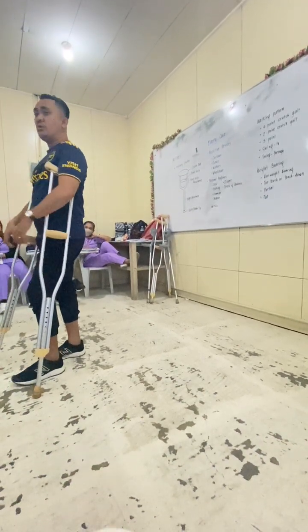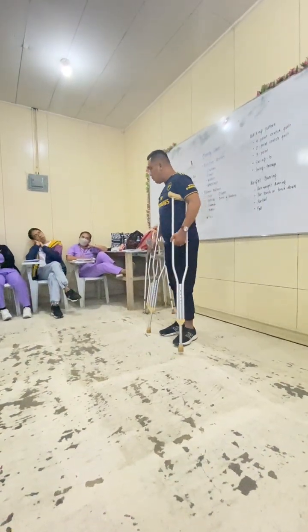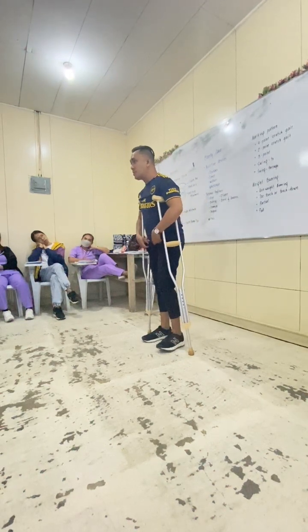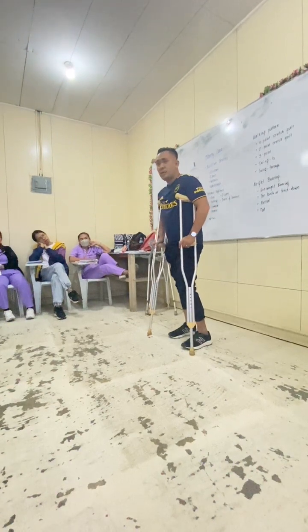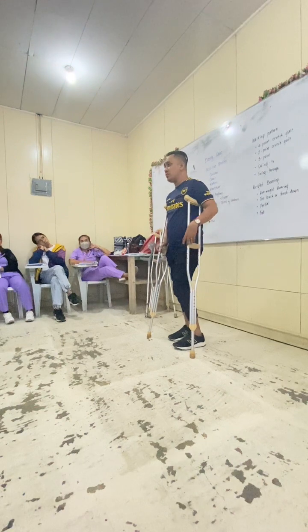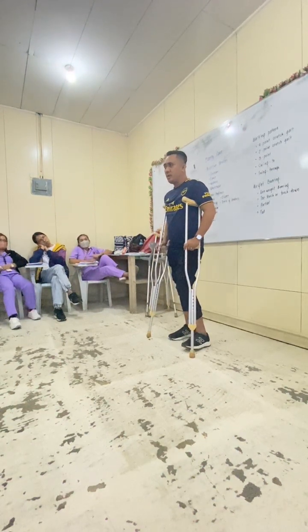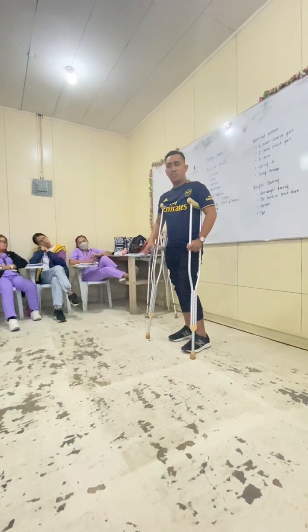During the assessment, pwede na po na ahead, depending on how the patient walks. Okay. So, you have to remember this one. During the assessment, what's the problem? Because of how they learn the walking pattern, medyo lisod kayo pagsabot nila.